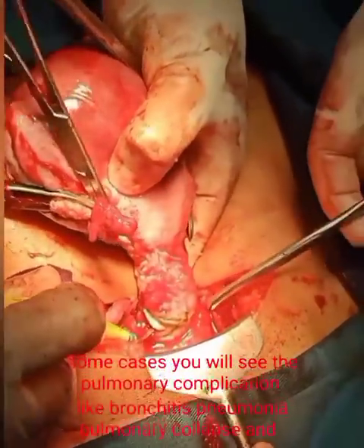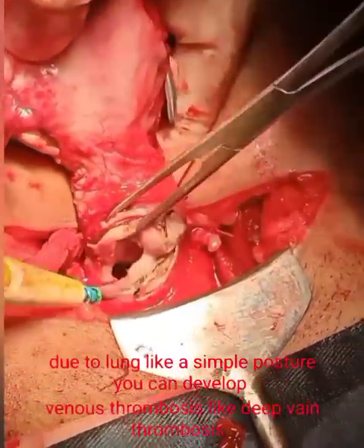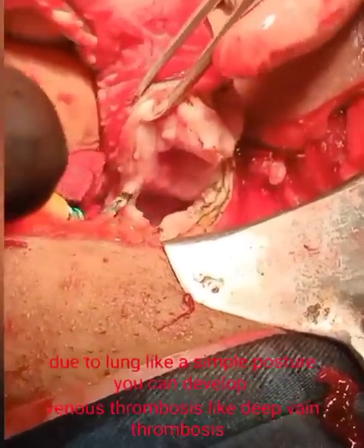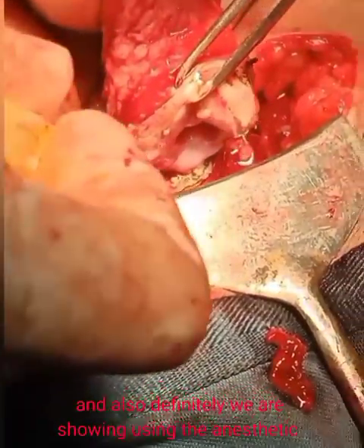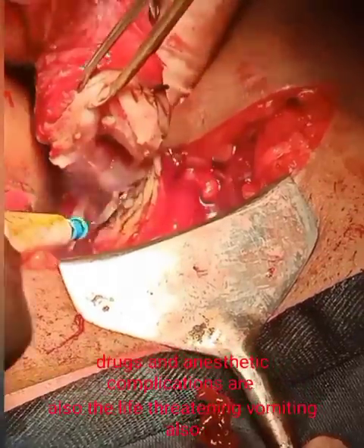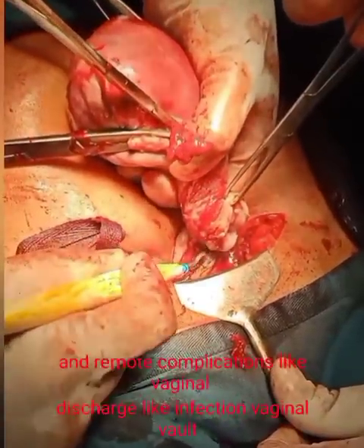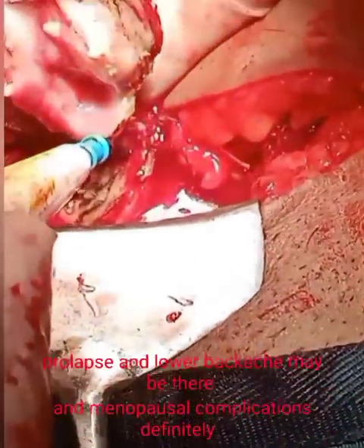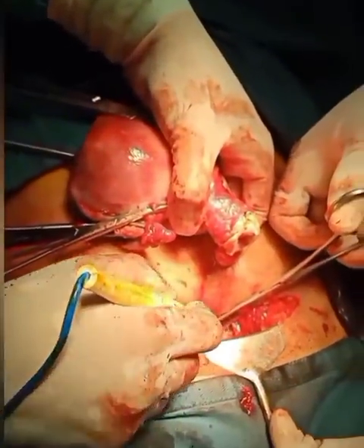You can now see the circumferential area — this is the cervix. The opened area of the upper vagina will now be closed. In vaginal hysterectomy, the uterus is removed through the vagina; it is less invasive than abdominal hysterectomy. The incision is inside the vagina, hospital stay is only 1 to 3 days, and recovery time is 4 to 6 weeks, though the cervix cannot be preserved.